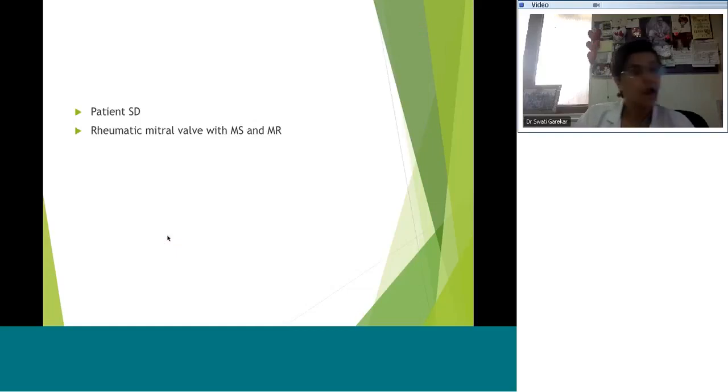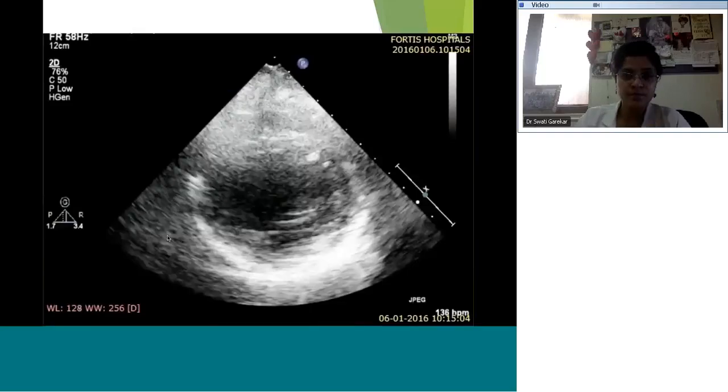We'll move forward. Let's move on to one more case of rheumatic heart disease this time. This is a teenager.